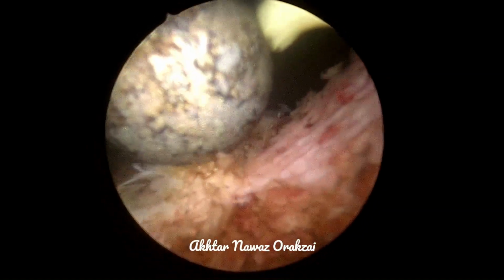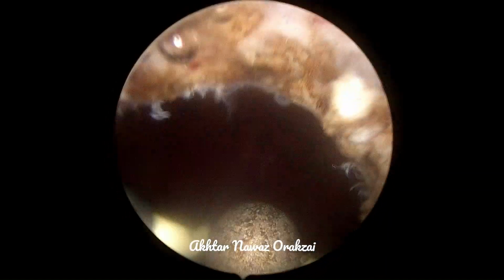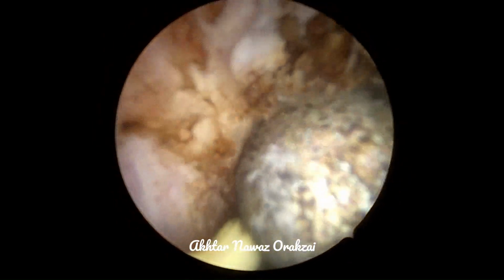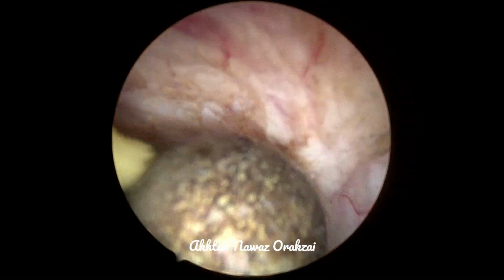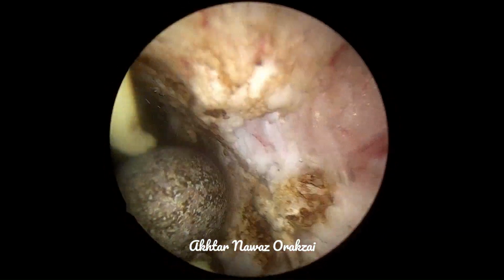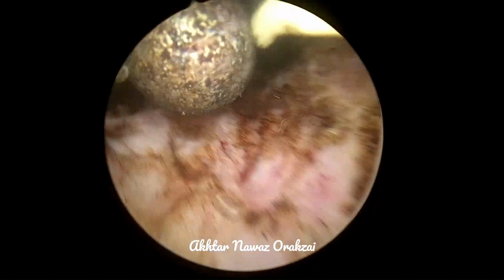Care must be taken. And now we have started coagulating the cavity. I usually start by coagulating the bladder neck fibers, not completely, because the more you coagulate this area, the more it is prone to bladder neck contracture and stenosis. However, the areas which are bleeding actively need to be properly coagulated.